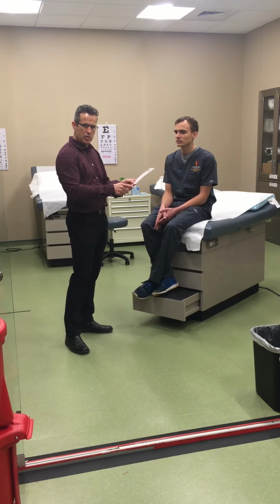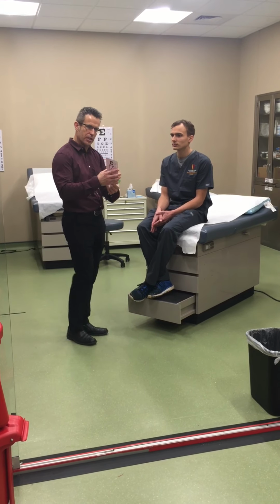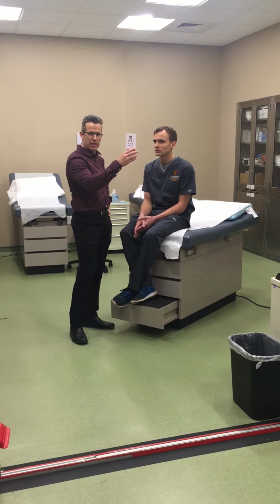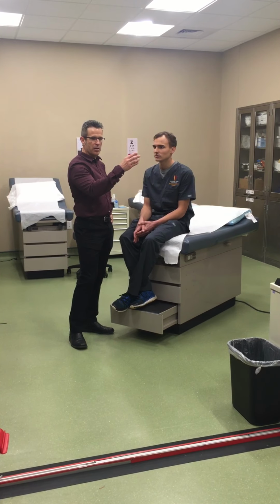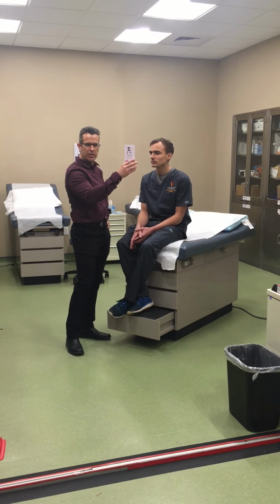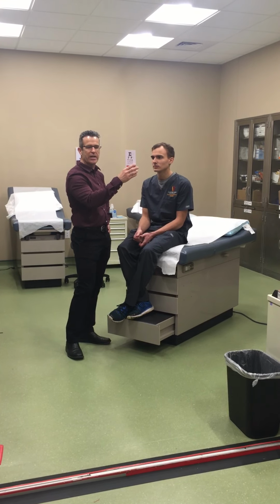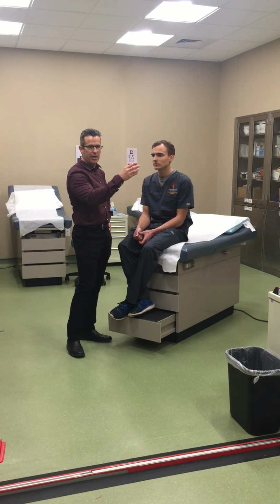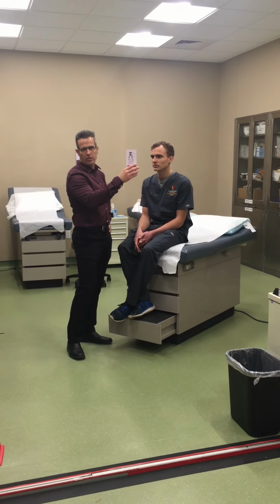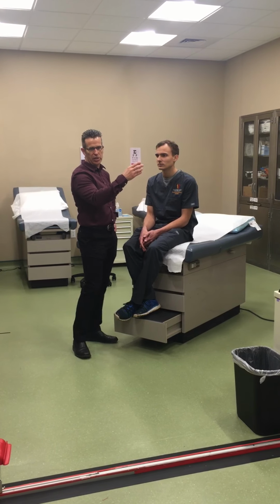Okay, this is a 14-inch card. So this will be a good one. It's a hole punch. Get a little string, take it to his chin, and that'd be about 14 inches. Cover, and so first off, you want to say, do you wear corrective lenses? No. So then we don't have to worry about testing with and without corrective lenses, okay? So that's just something you can voice in the formative. Even if they wear corrective lenses or glasses, you only have to check one, okay? And then just voice that you would check it with both.